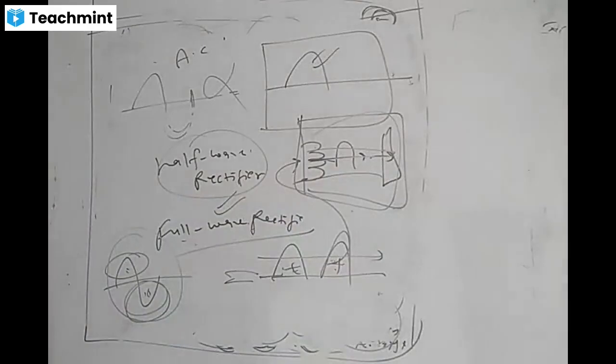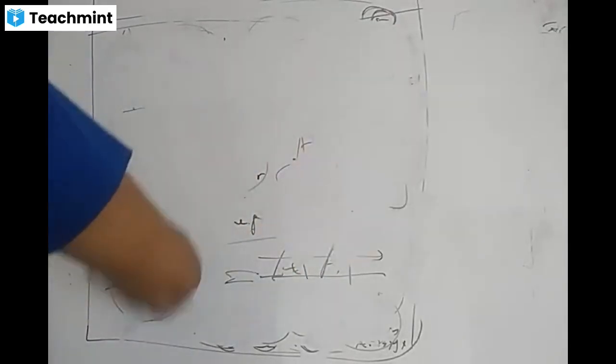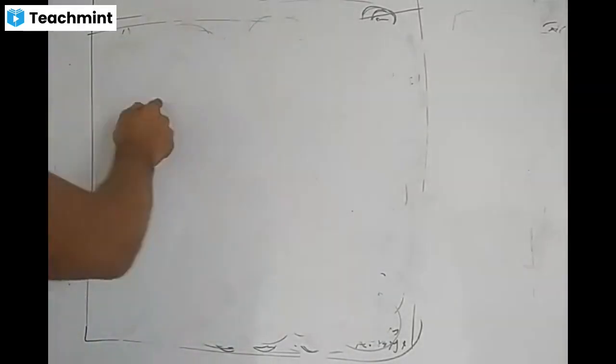So the X-ray tube will not work on AC current. If you forcefully give AC current, then the electrons will first go to the anode, then reverse back and damage your cathode. So the option left is rectification. Rectification means we convert it into only one direction so that electrons can move only from filament to anode.